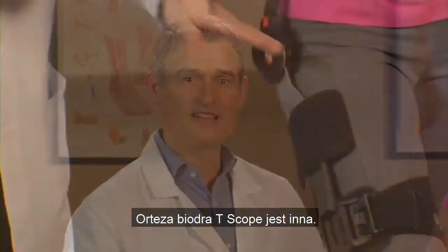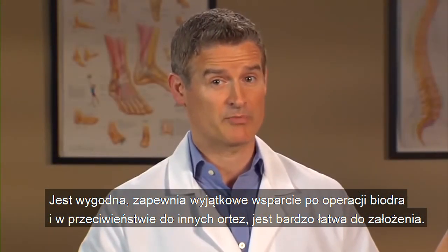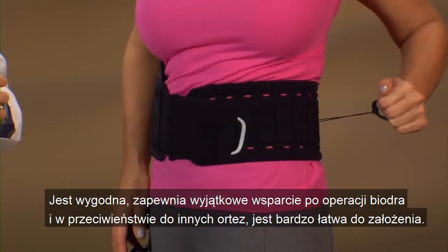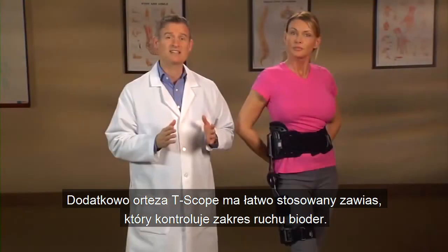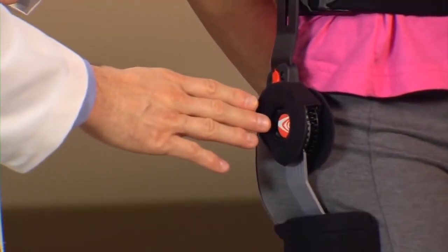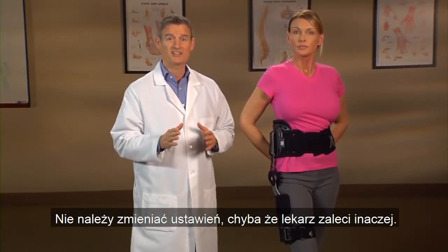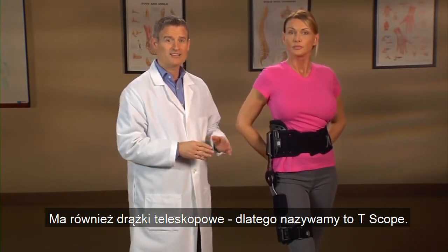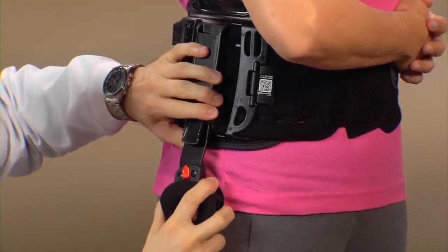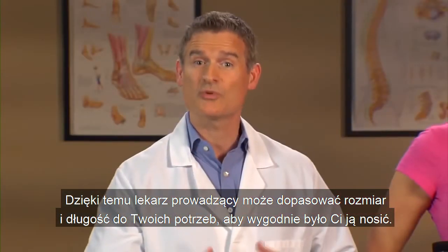The T-Scope hip brace is different. It's comfortable, it provides exceptional support after your hip surgery, and unlike some other braces, it's very easy to put on. Additionally, the T-Scope hip has an easy-to-use hinge that controls your hip's range of motion. Your doctor will determine the range settings. You should not change the settings unless your doctor instructs you to do so. It also has telescoping bars — that's why we call it T-Scope — so your doctor or clinician can adjust the size and length to fit you, so it's comfortable to wear.